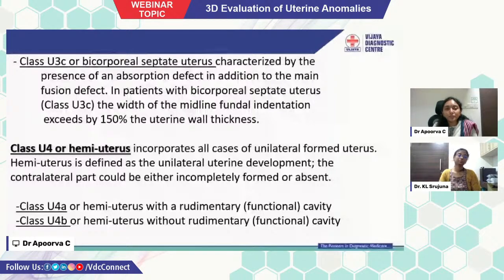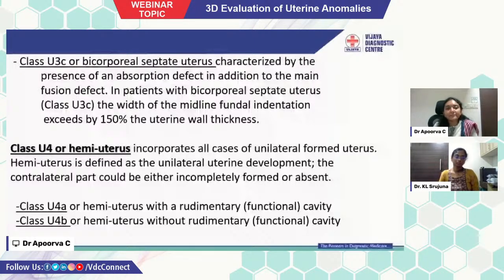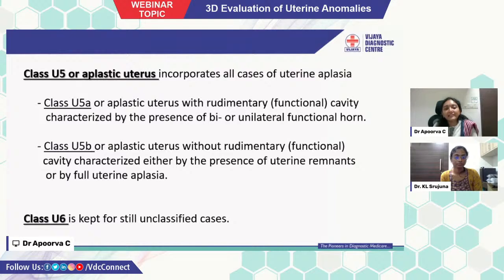In patients with bicorporeal septate uterus, the width of the midline fundal indentation exceeds 150% of the uterine wall thickness. Class U4 or hemiuterus incorporates all cases of unilaterally formed uterus, defined as unilateral uterine development where the contralateral part can be either incompletely formed or absent. It is divided into class U4A (hemiuterus with rudimentary cavity) and class U4B (hemiuterus without rudimentary cavity). Class U5 or aplastic uterus incorporates all cases of uterine aplasia, divided into U5A (aplastic with rudimentary cavity — bilateral or unilateral functional horn) and U5B (aplastic without rudimentary cavity).